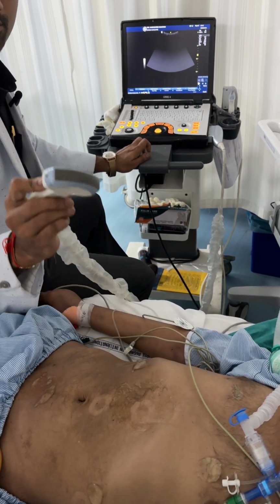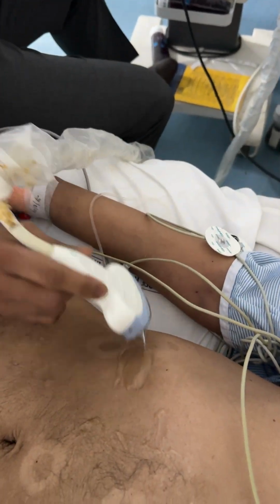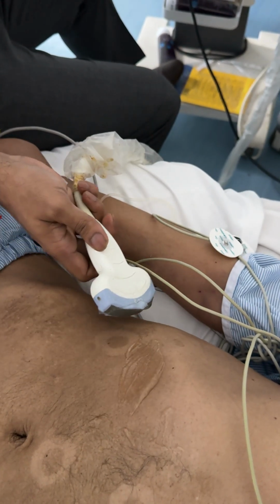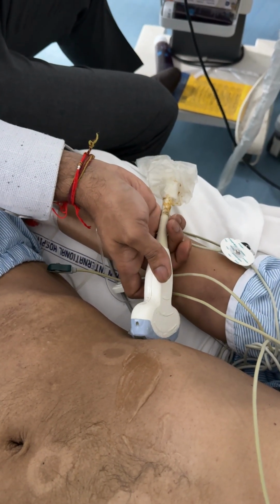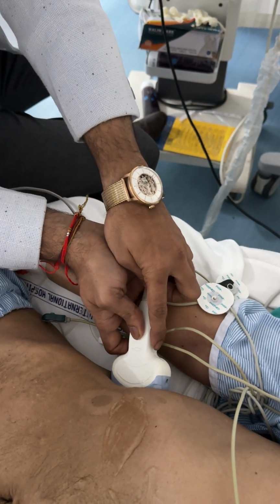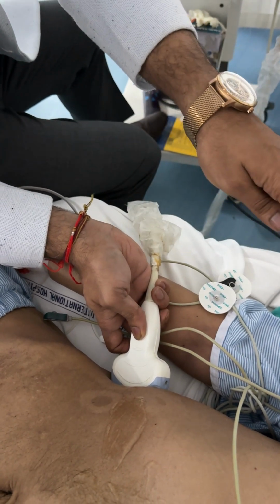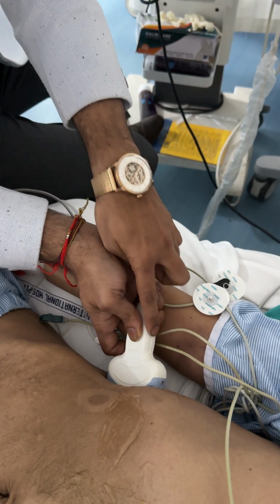Now we are going to see the right upper quadrant. Just focus here. On the right side, what we need to do is take the probe, and the probe can be placed in three ways basically. This is the horizontal orientation, this is the vertical or the sagittal orientation. In the sagittal orientation, the marker has to point cephalic, and the probe has to be like this.